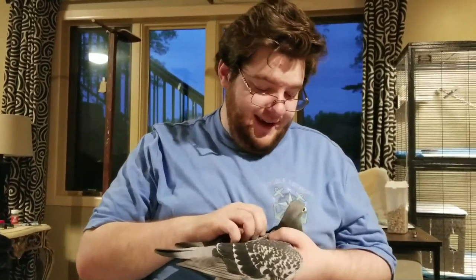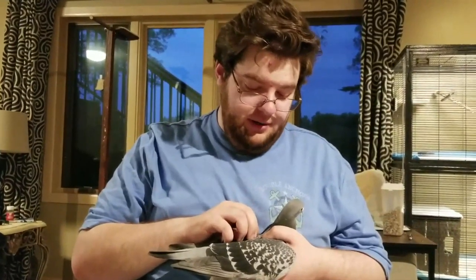I'm going to show you how to wing wrap a bird. This here is Finn. Finn was actually the bird I learned how to wing wrap on. This wing here came in broken.